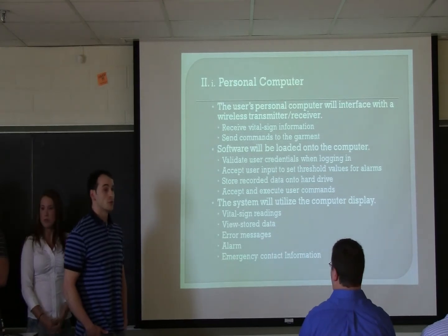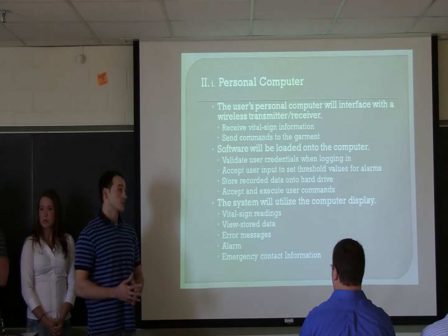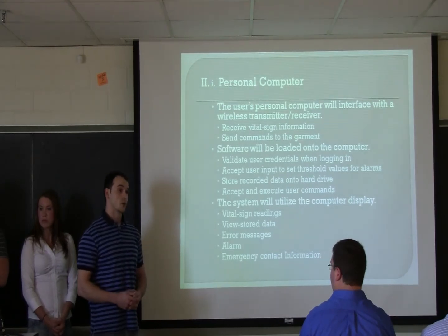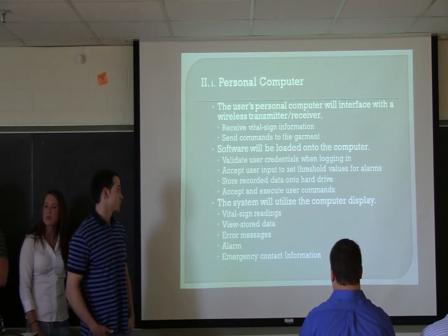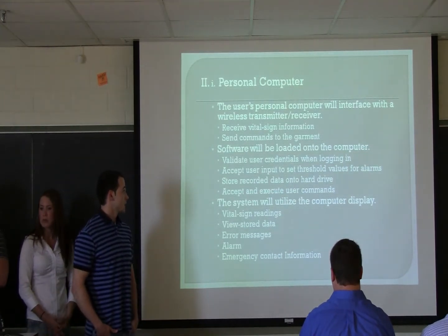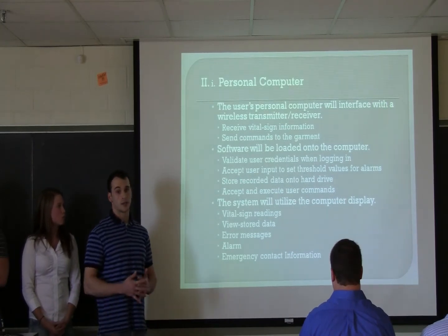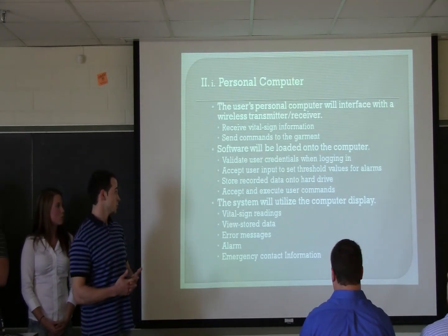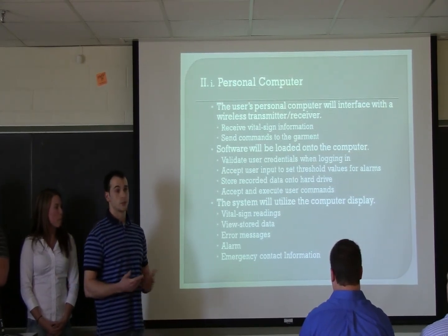The other component, the personal computer, will receive all the vital sign information from the child, and it'll also be where the user transmits commands, like if they want to view the data that's been recorded. Like I said, the software will be loaded onto the computer. It does a couple of functions: it will validate the user's credentials, store the recorded data from the infant onto the hard drive, and send user commands.